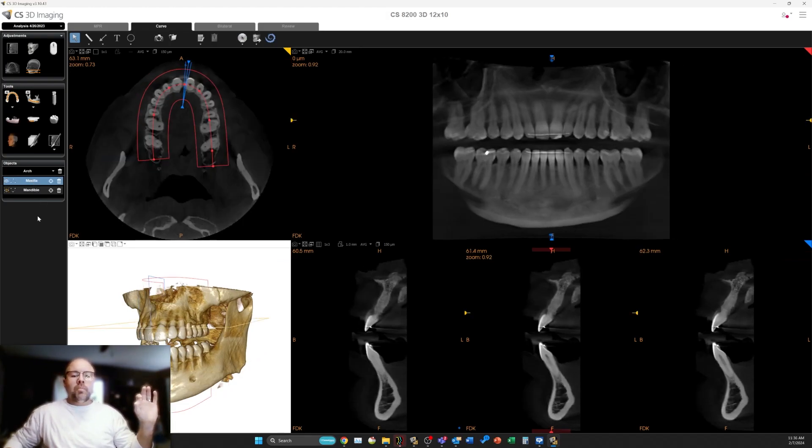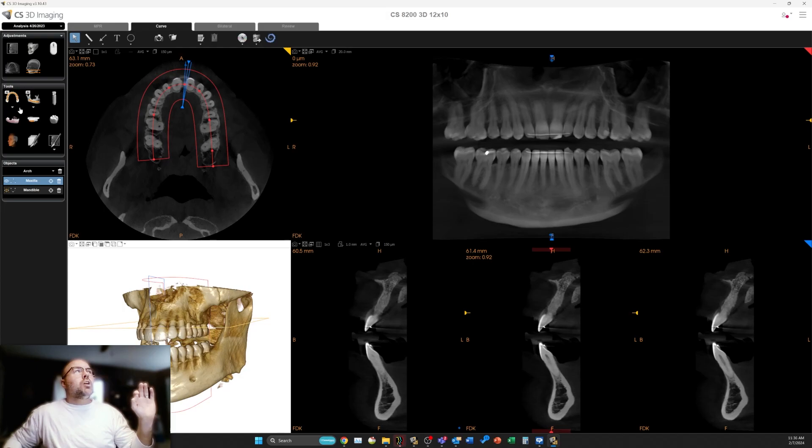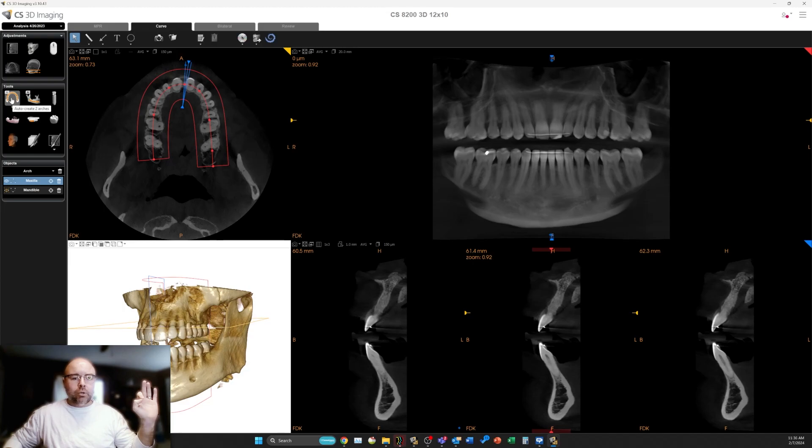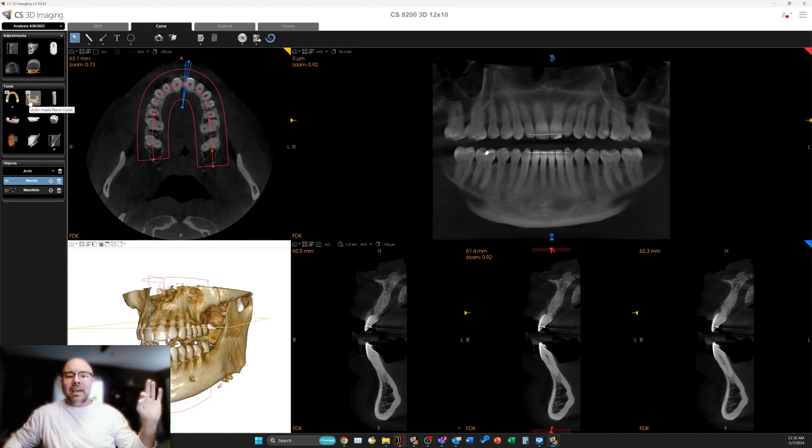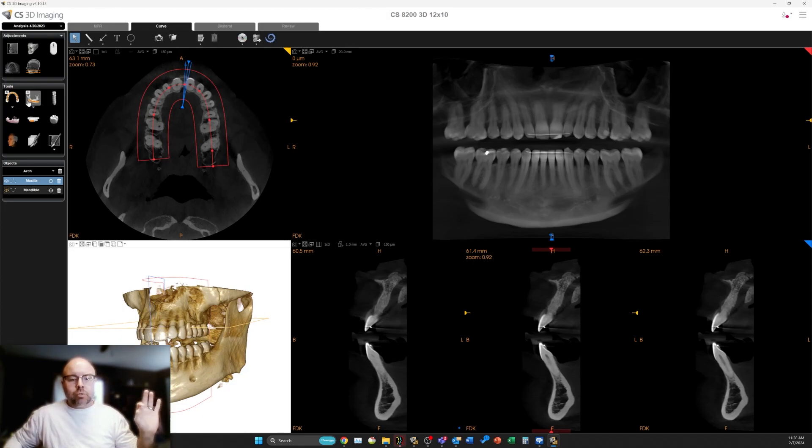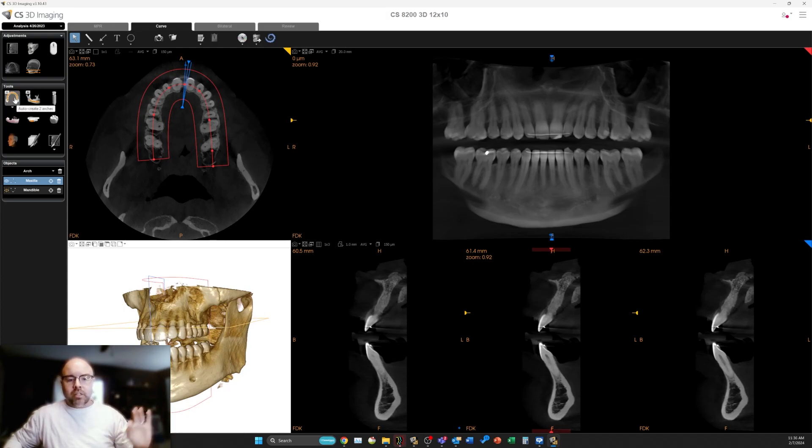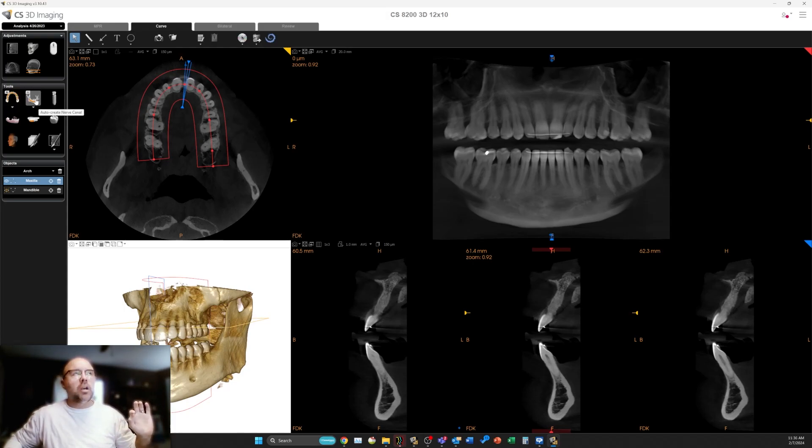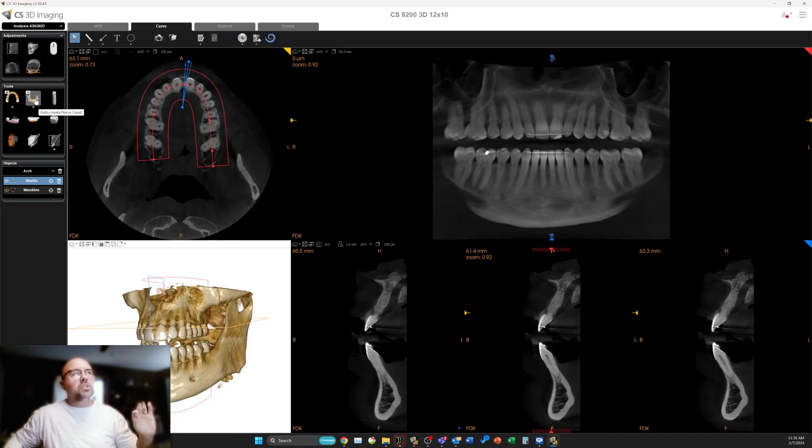We notice here in the tools box we have the AI auto arch tracing, which we've had for a very long time, but now we have the AI nerve tracing tool. We have auto nerve tracing that's included. In order to use this, we have to use the auto arch tracing. This doesn't work if you're going to trace the arch yourself.